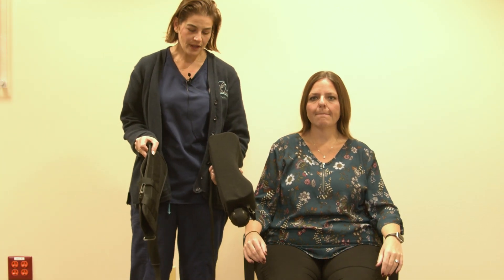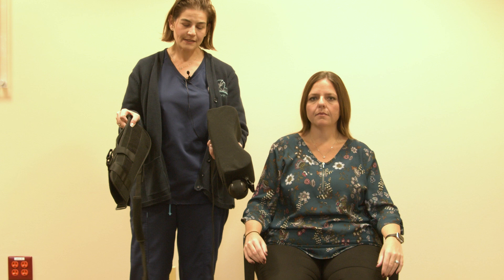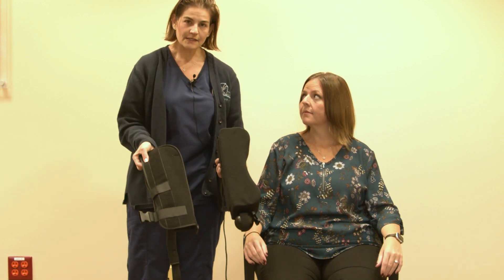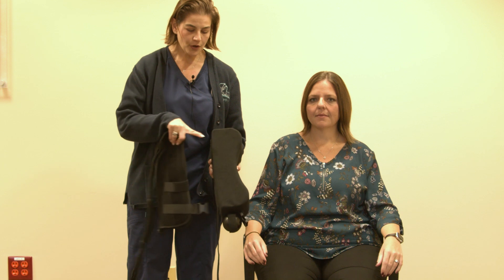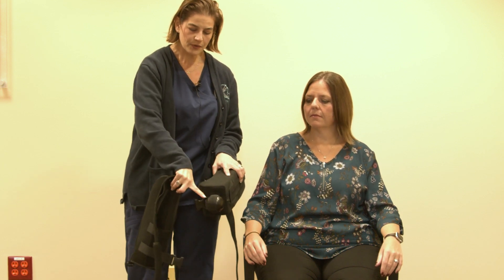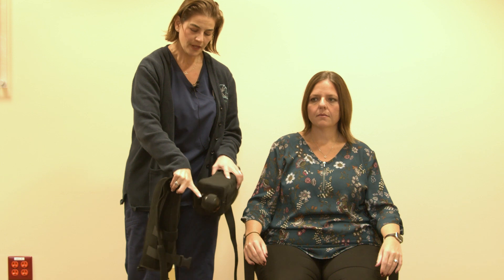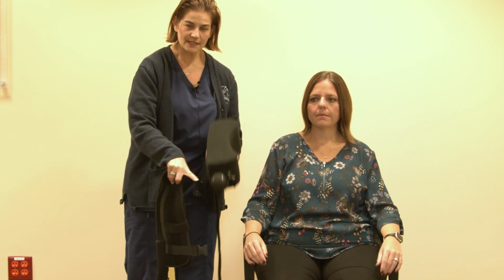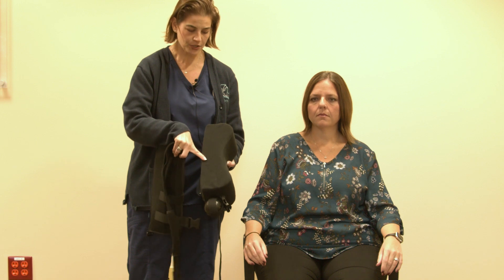Your abductor sling comes with two separate pieces. This is the abductor pillow and this is the sling itself. You're going to want to first apply the abductor pillow, which also comes with a resistance ball. This ball is detachable. For the purpose of this video, it's going to stay with the wedge.